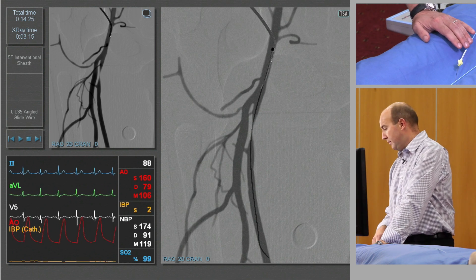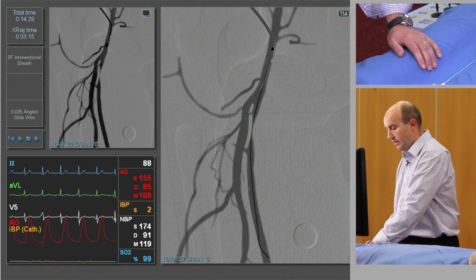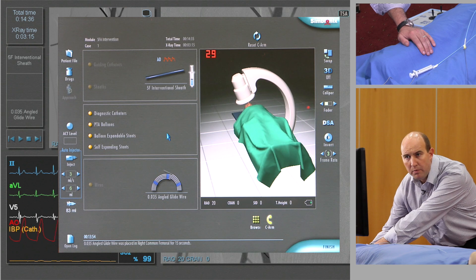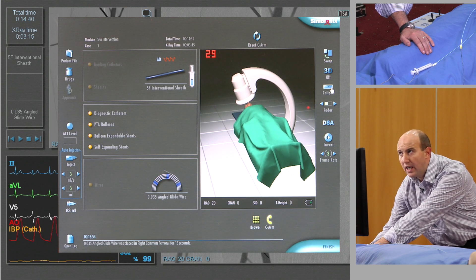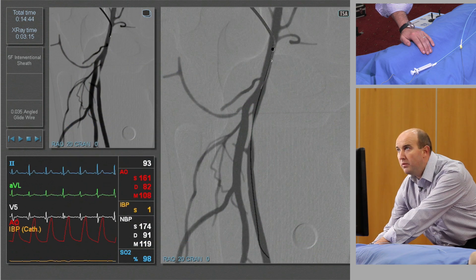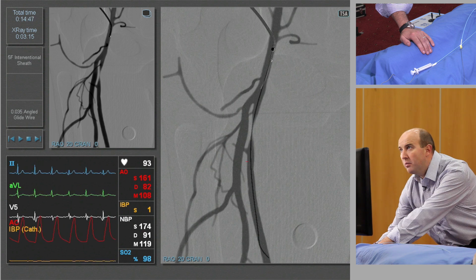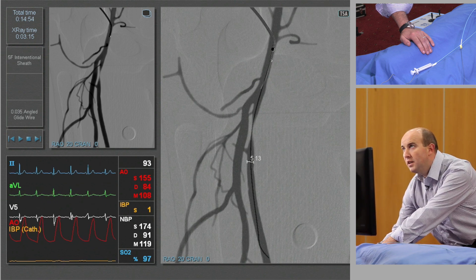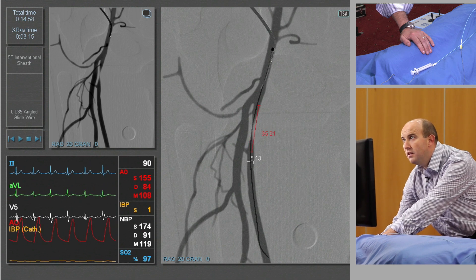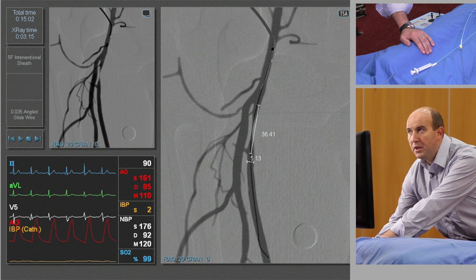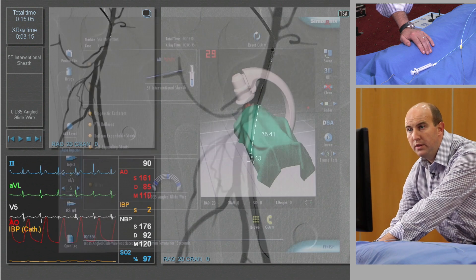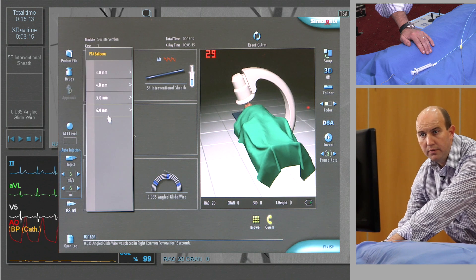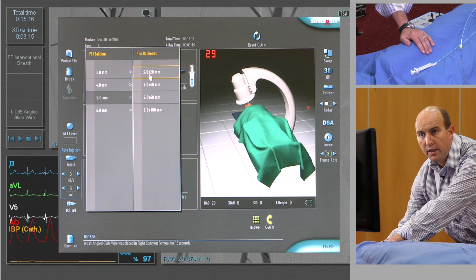At this stage what I'd normally do is give some heparin, and because we have successfully negotiated the lesion we leave the wire in. Then if we go to the active screen, the first thing we could do is measure the vessel — go to caliper, take your cursor over to the SFA, and click one side of the vessel wall. It's a five millimeter vessel, and the lesion length is nearly four centimeters. So a five by 40 millimeter balloon would not be an unreasonable choice. We clear those markings and select an angioplasty balloon — five by 40 millimeter.